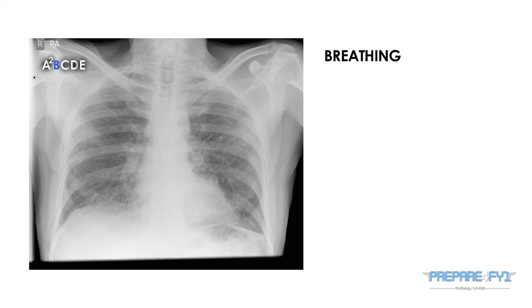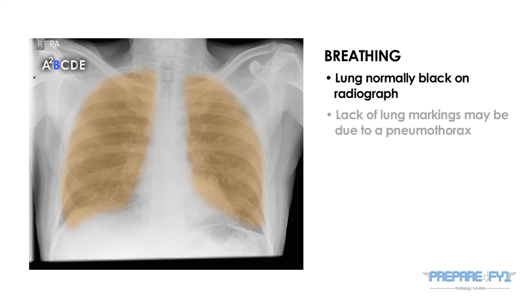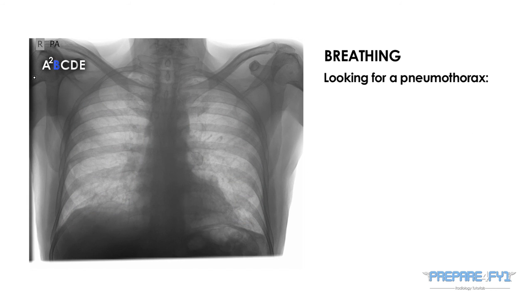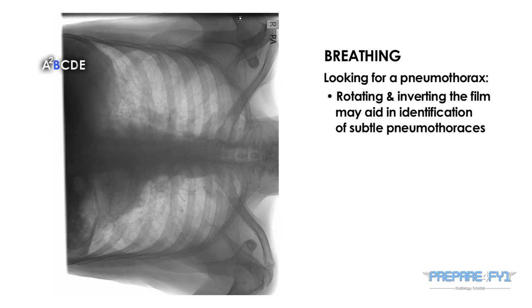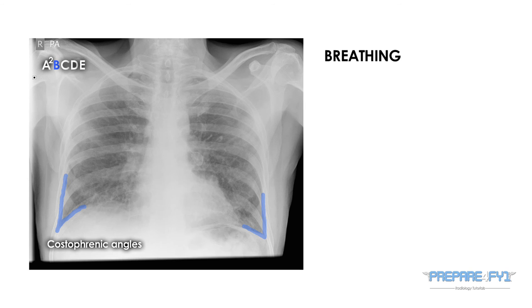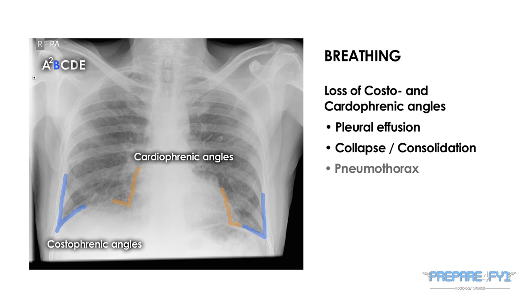B is for breathing. The lung is black on a radiograph with visible vascular markings going out to the periphery, and if they do not go out to the periphery, this may be the result of a pneumothorax. When looking for a pneumothorax, it can be useful to invert the colours on the radiograph and/or rotate the film. You can clearly see the costophrenic angles and the cardiophrenic angles outlined here. These angles can be blunted or lost in pleural effusion, collapse, consolidation, and pneumothorax.